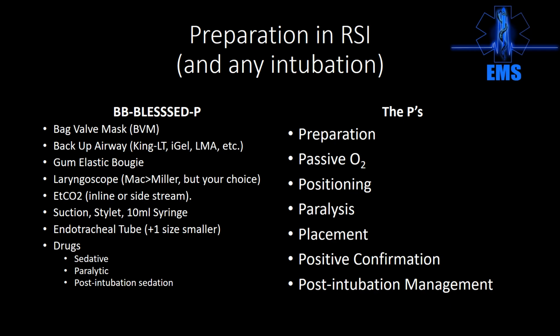So before you tube the patient, pull up the post-intubation sedation because you're going to forget. Every time somebody drops the tube, there's a high five moment with the whole crew, and then the patient starts bucking because nobody remembered to give the patient the Versed or the ketamine after we intubated the patient. And now the patient is totally alert and aware of what's going on and has a piece of plastic between their cords. That's a party foul. That's points that are deducted for style. So draw them up before.